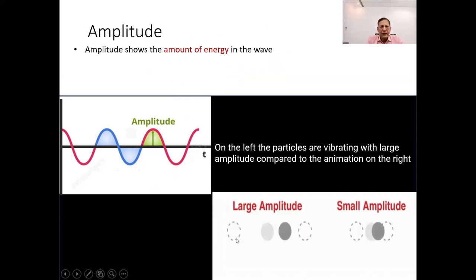The greater the amplitude of the wave, the further these particles are displaced from their usual resting position. This displacement reflects the energy carried by the wave. In summary, amplitude represents the strength or amount of energy a sound wave carries. In ultrasound imaging, amplitude also relates to the brightness of the echo displayed on the screen. A stronger echo resulting from a higher amplitude appears brighter on the ultrasound image. This helps clinicians to interpret the strength and characteristics of the structures being imaged.